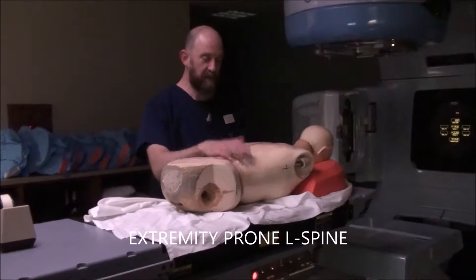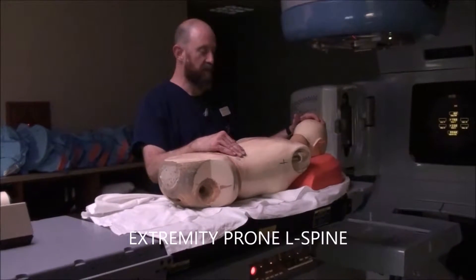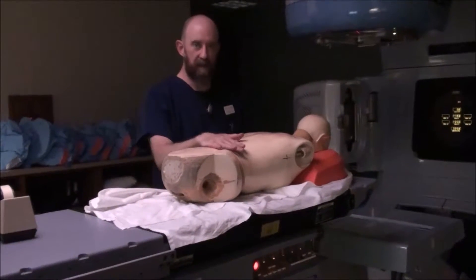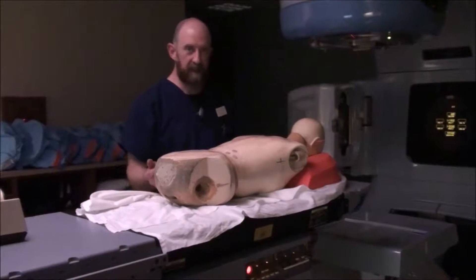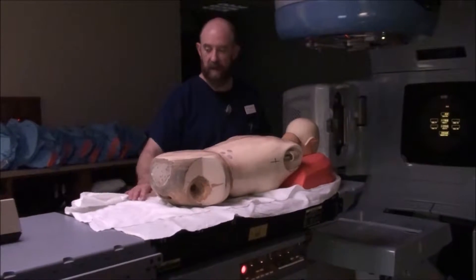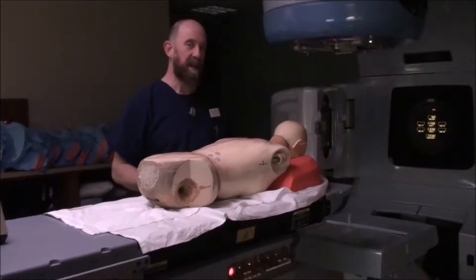For extremity simulation, the first thing we're going to go over is a prone L-spine. You may or may not be seeing prone L-spines in your clinic. This is something that historically has been treated as a pretty standard treatment.